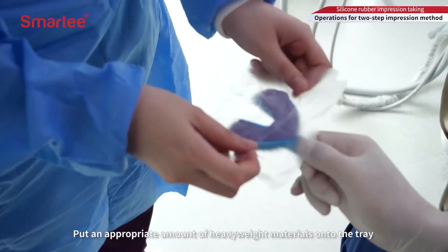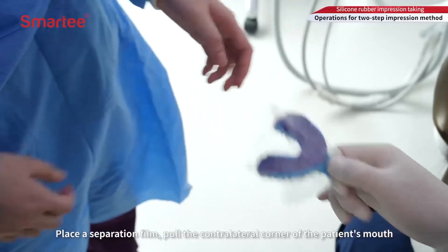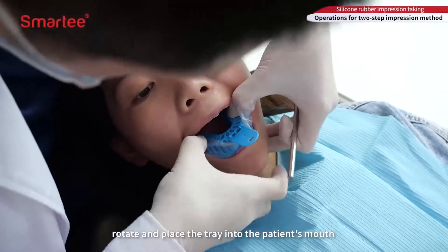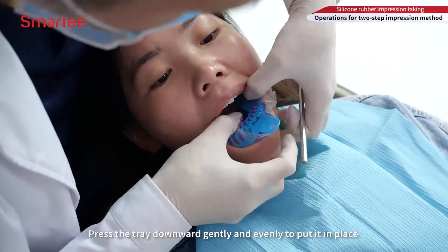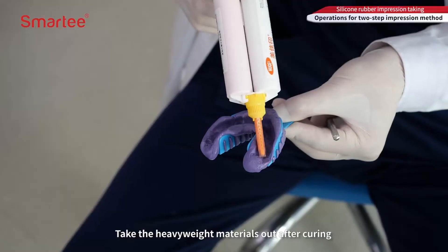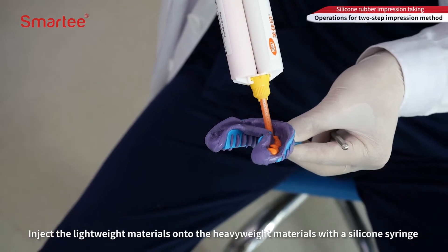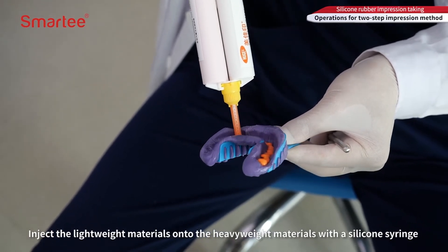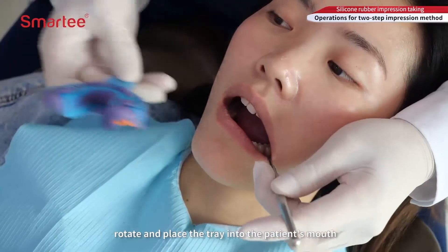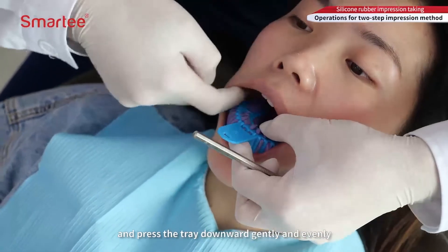Put an appropriate amount of heavyweight materials onto the tray. Place a separation film, pull the contralateral corner of the patient's mouth, rotate, and place the tray into the patient's mouth. Press the tray downward gently and evenly to put it in place, then take the tray out after curing. Inject the lightweight materials onto the heavyweight materials with a silicone syringe. Pull the contralateral corner of the patient's mouth, rotate, and place the tray into the patient's mouth, pressing the tray downward gently and evenly.